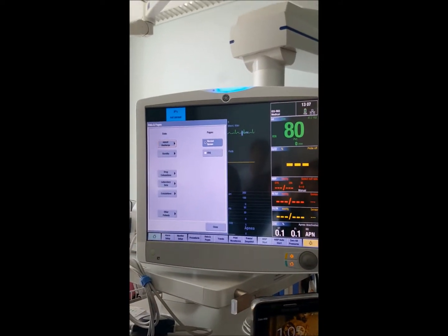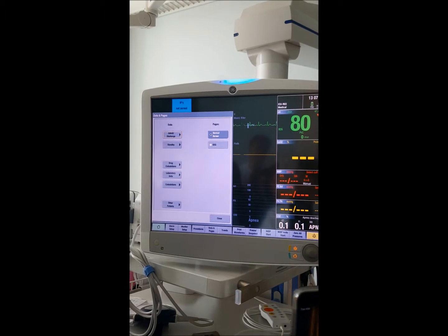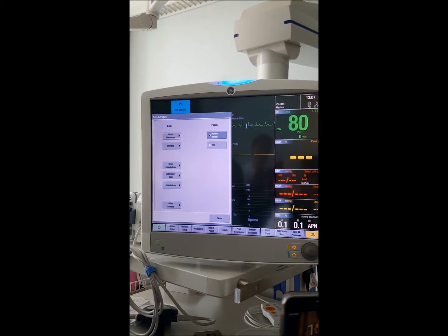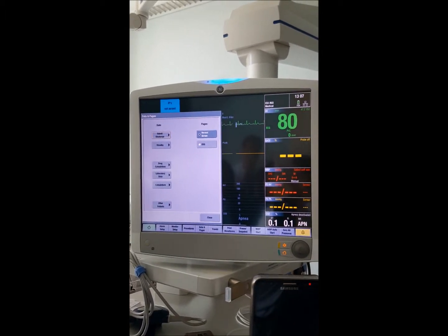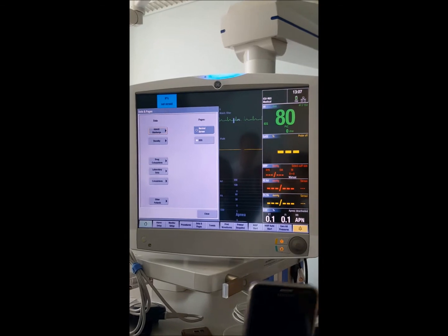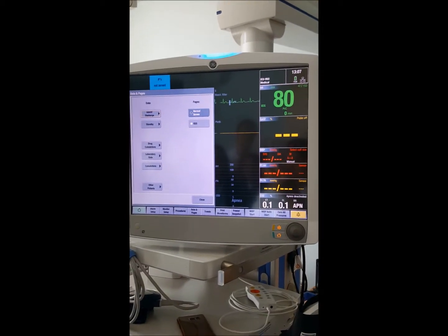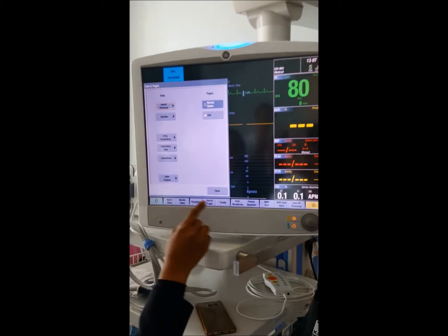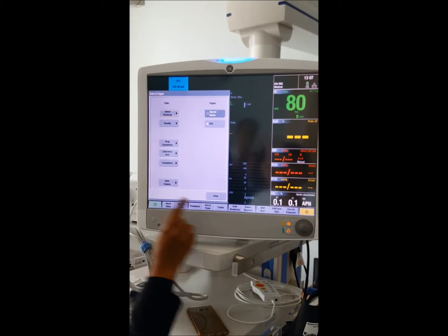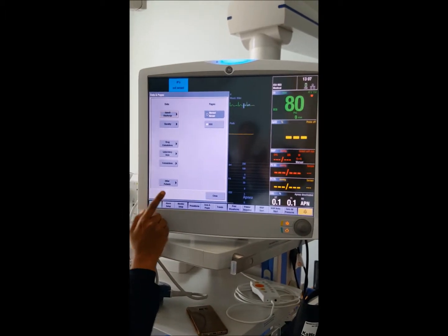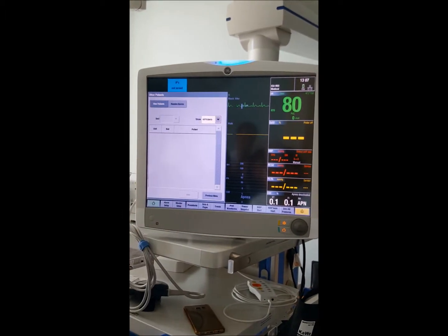Next is data pages. There is a button called 'Other Patients' — this allows you to view a patient in another room, say room 15, without going there. You press 'Data Pages' and then 'Other Patients' to bring their screen up here.